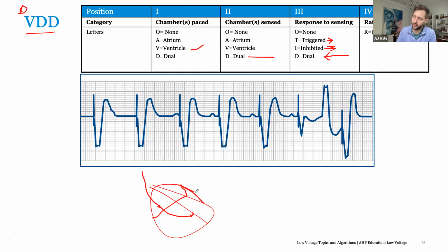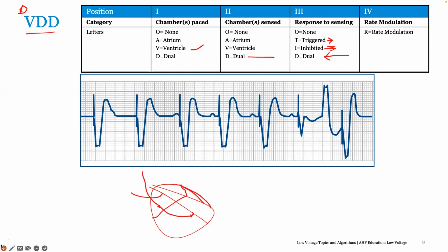Elvis, I'm going to pick on you again. Do you know a reason why we do this over having an atrial lead? I'm not sure of the reason, but I believe it's likely they believe that the sinus node is fine. I just believe perhaps they have that assumption that the sinus node is fine. There's no need of putting an atrial lead. Just go ahead with the single pass.